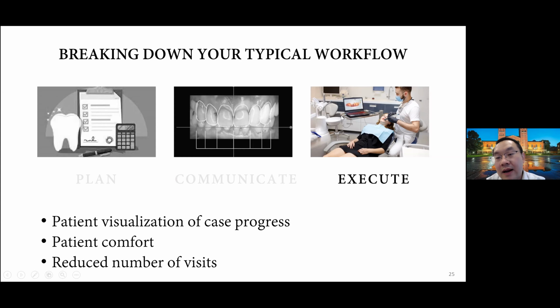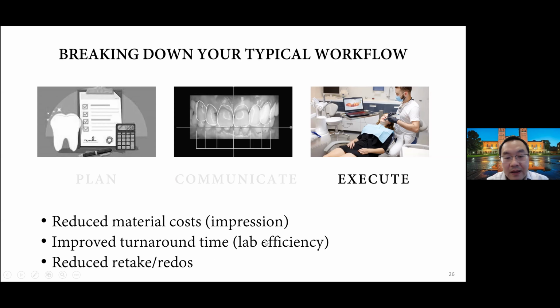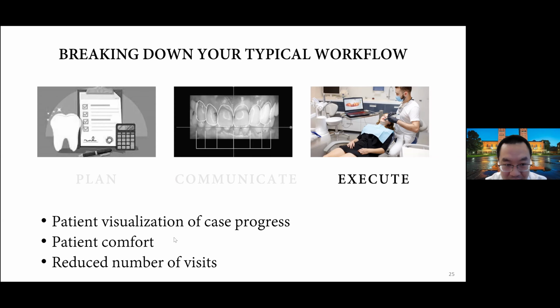So you can send the lab for the final design, but always do a simple crown design in 3 to 5 minutes, right? The patient can see your tentative crown design, have an idea how the final crown is going to look like, right? They will be impressed by you. Patient comfort, there's no more gluey material, the traditional impression material. So patient comfort is better.